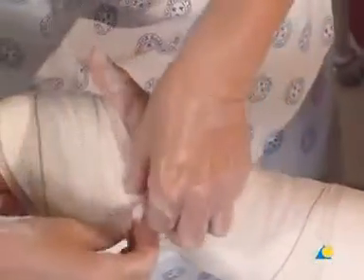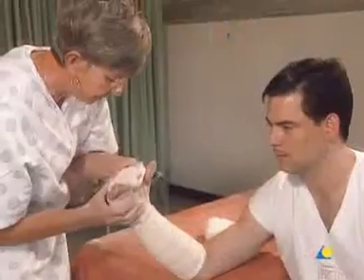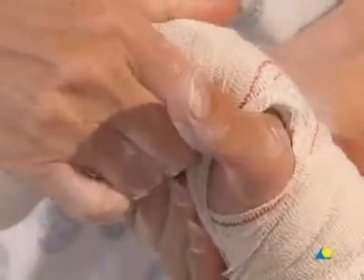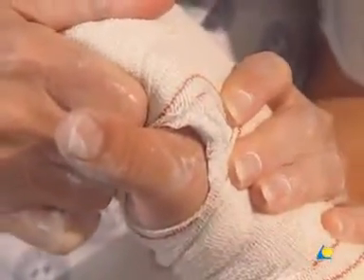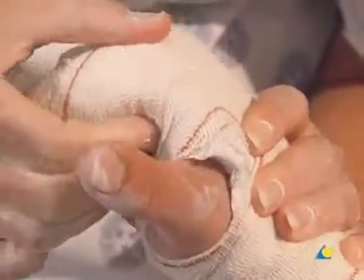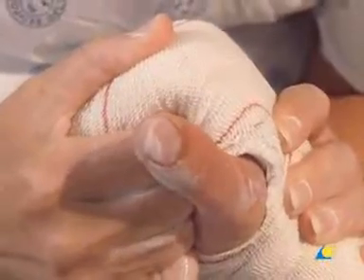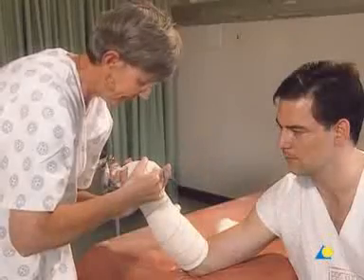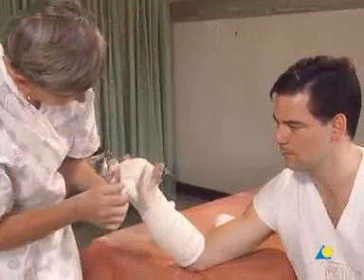The loose end of the crepe bandage is secured. The plaster is now molded with pressure from two fingers around the shaft of the metacarpal and pressure from the thumb over the head of the metacarpal. Counterpressure is applied with the other hand to ensure 90-degree flexion of the MP joints to prevent stiffness. The wrist is supported to avoid over-flexion. The pressure is maintained until the plaster has set; however, the plaster will not reach full strength for 36 hours.